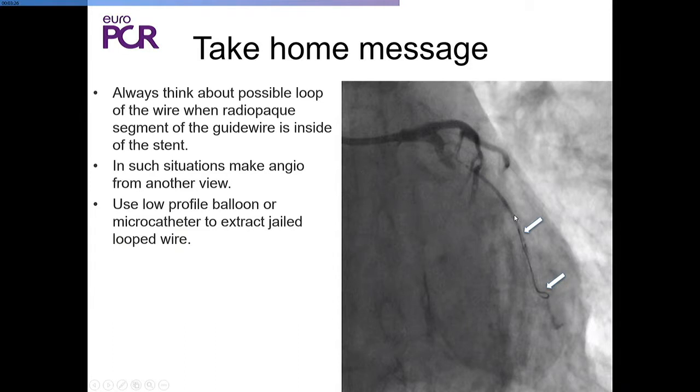What do you think about using OCT immediately, not after nine days? I know I heard that the patient was in cardiogenic shock, but in one similar situation, I used OCT immediately and saw that half of the stent was expanded and the other half was not expanded, and it made the rest of the procedure easier. Yes, that's good. But as you heard, the patient was in cardiogenic shock, and we had restored free blood flow and wanted to finish the intervention as fast as possible.